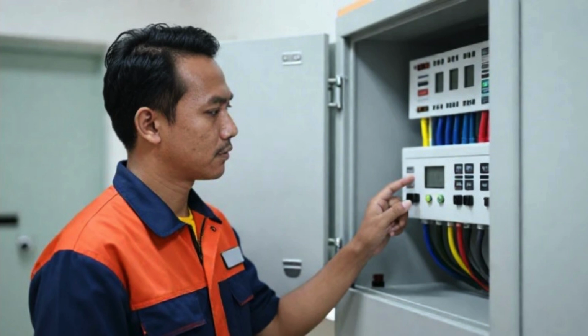facilities. Medical equipment operates in close contact with the human body, often in environments where patients are weak, unconscious, or highly vulnerable. Because of this, even a small electrical fault can have serious consequences. Unlike industrial or household devices, medical equipment must meet much higher safety standards to ensure that electrical energy does not harm the patient or the operator.